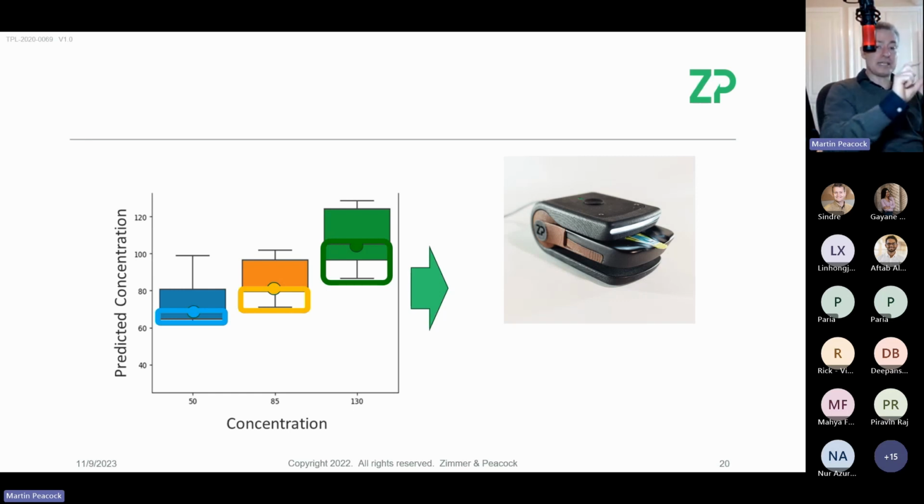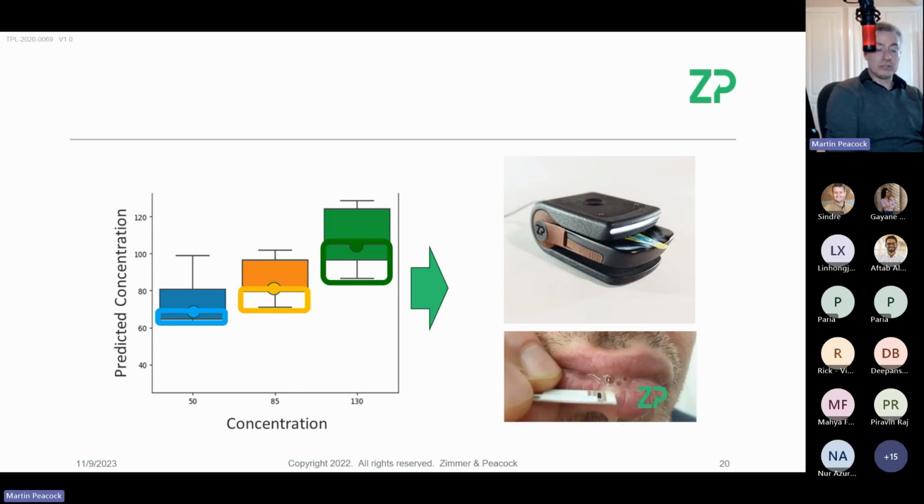We would immediately be taking the lab protocol and the sensors that were developed in the lab, putting them on this hardware, and going into, I would say, preclinical trials. Literally going into some sort of semi-clinical setting and just testing it. Now, it's not saying that we're going into the clinic and making clinical decisions on it. We're just gathering data.